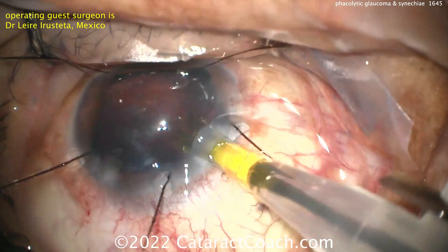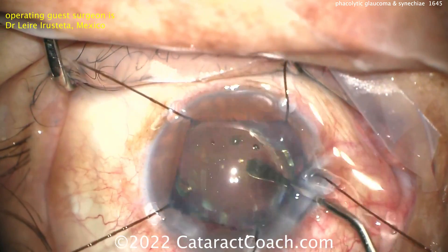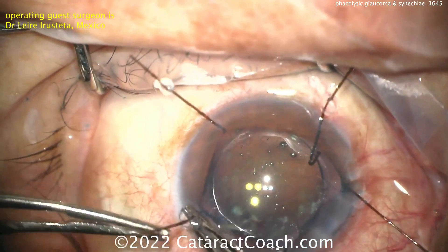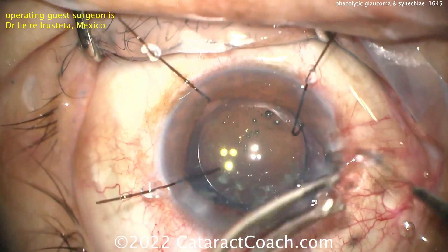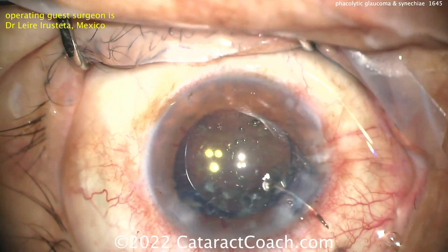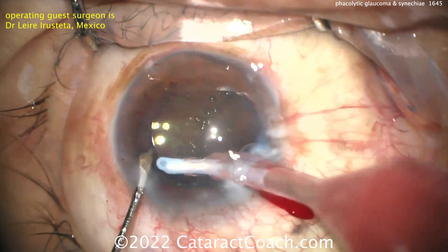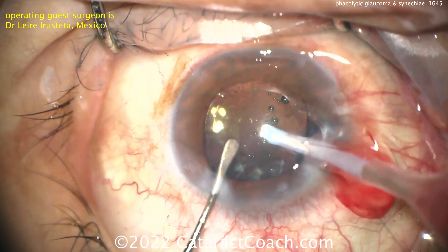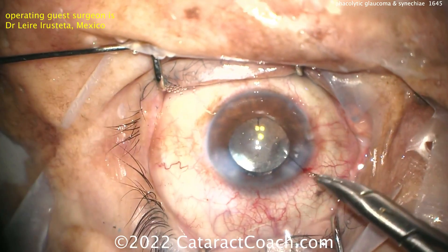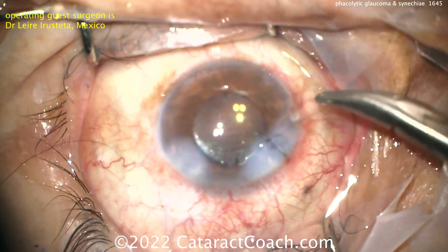Here comes the IOL — a single piece monofocal acrylic placed in-bag in primary position. Get that opened up in the capsule bag. We can take the hooks out now, and you may also want to try to remove some more of that fibrotic lens material if you can — but if you cannot, it doesn't really make a difference. This patient is going to have an incredibly big transformation in vision. At the end of the case, a suture was placed and a little irrigation-aspiration to remove the viscoelastic. I like the idea of the suture too. Beautiful case — you did a fantastic job. Lucky patient.